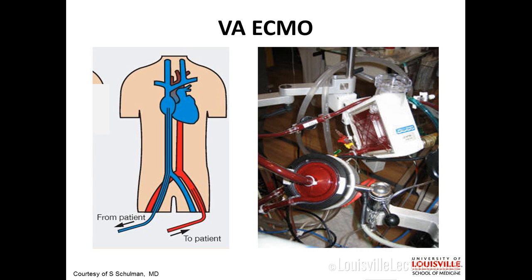This is essentially bypass, right? When someone goes on cardiopulmonary bypass in the OR, this is exactly what they do, only they have a giant machine for it. So this is bypass at the bedside. That's how I describe it. This provides full support. It's providing full cardiac output, and it's doing the job of the lungs.